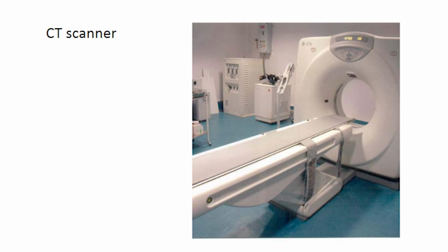Source and detector can be rotated to cover whole slice scan of the tissues of interest. Helical movement of the tube or movement of the patient in and out can create images in various transverse planes, and by combining these 2D images, 3D images can also be reconstructed.